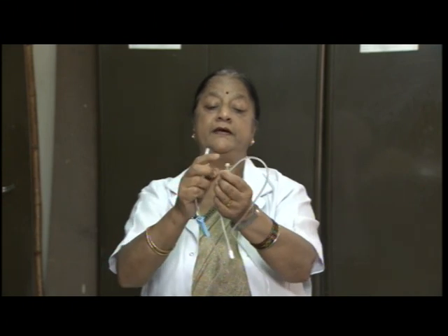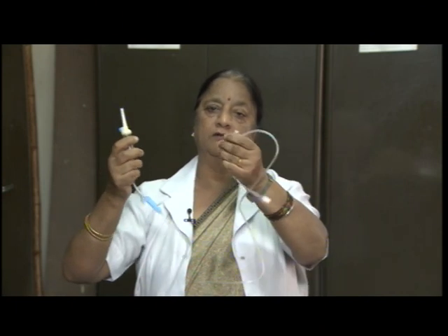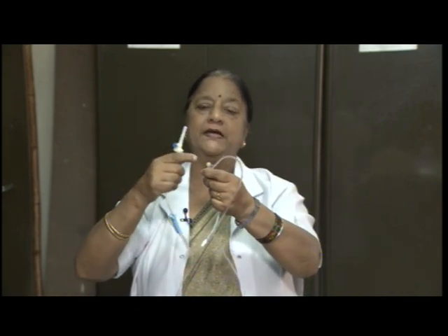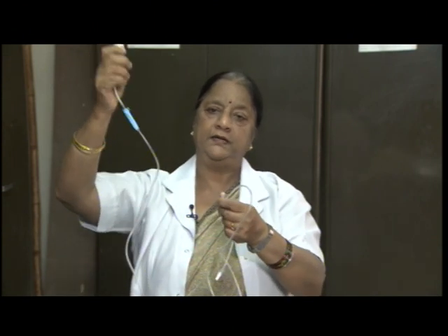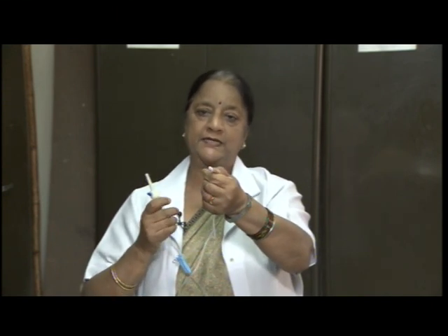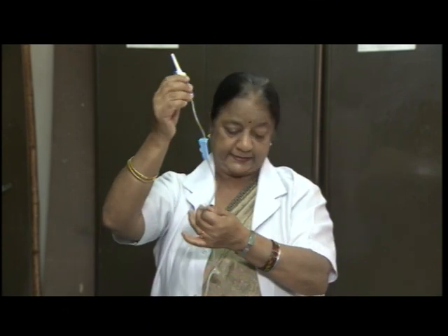Here you can introduce any other fluid along with this, sometimes even medications which are ordered along with the IV fluid can also be given. And this goes to the patient's vein, blood vessel, with the help of a needle. So, this is the IV set, intravenous infusion set.